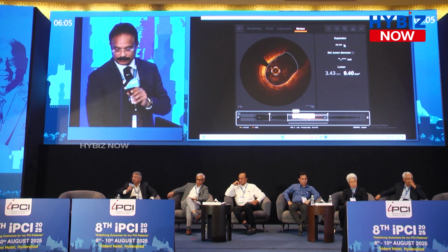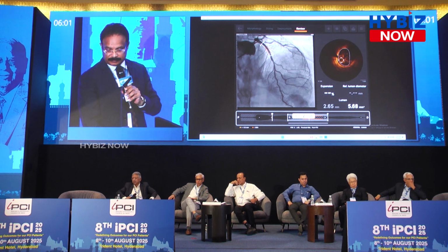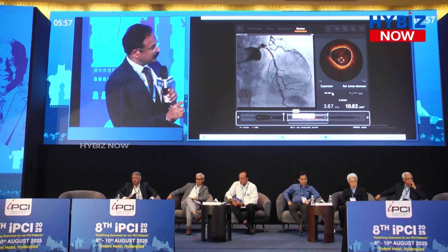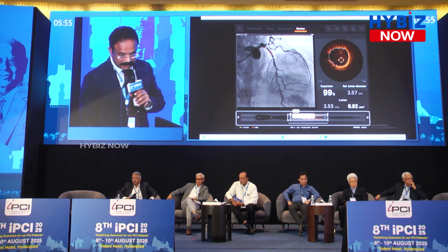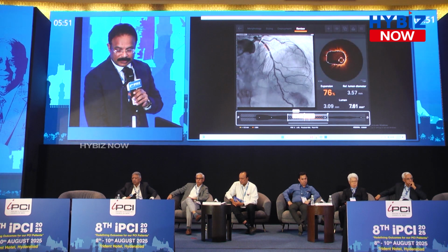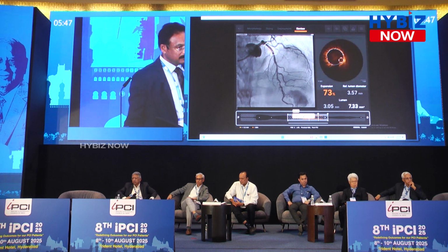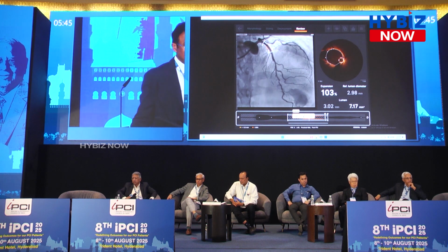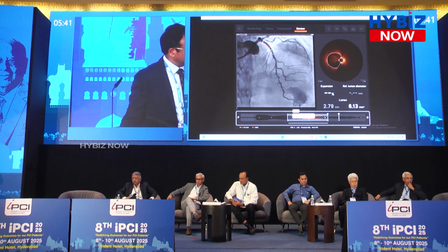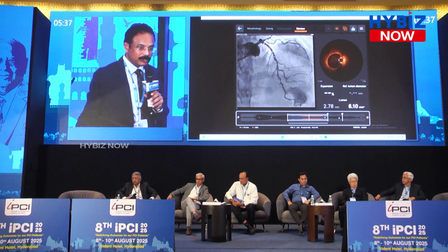May I co-register it, please? And now you can see the automatic detection. You can see some amount of under expansion. That also depends upon what modality you are using or fed into your computer. If this is a tapered modality of measuring the under expansion, that orange is showing under expansion.